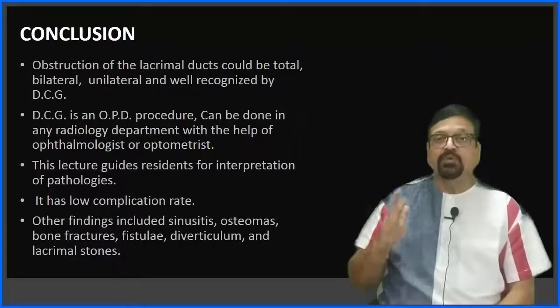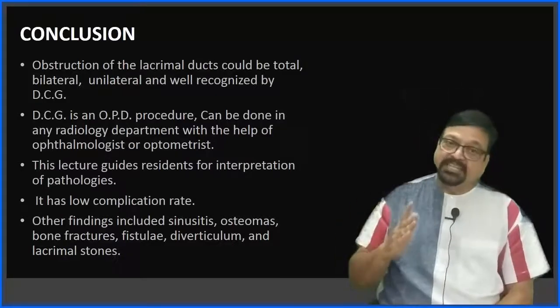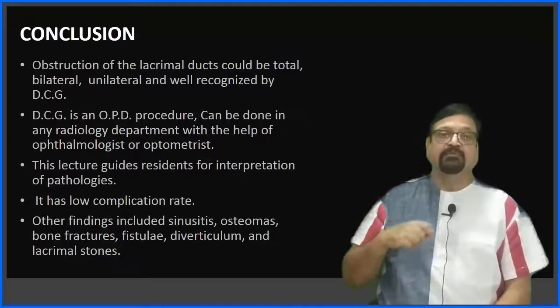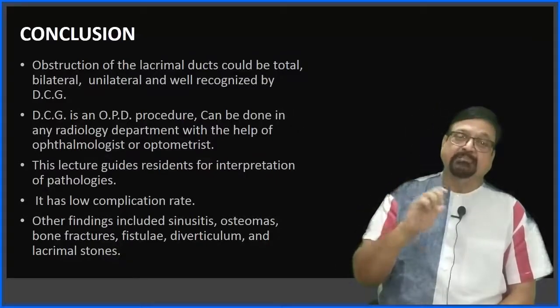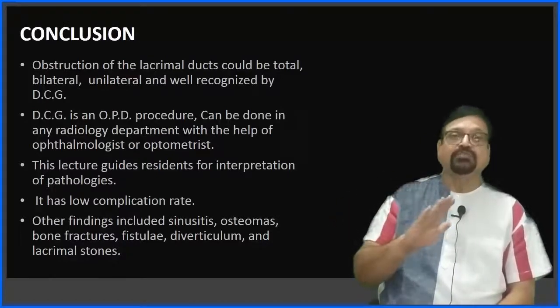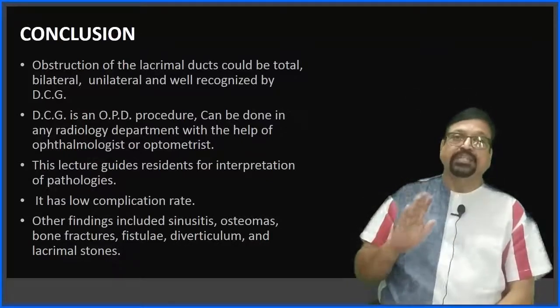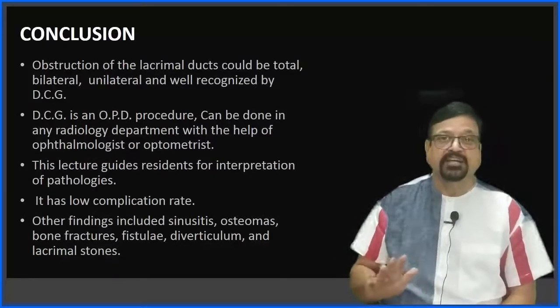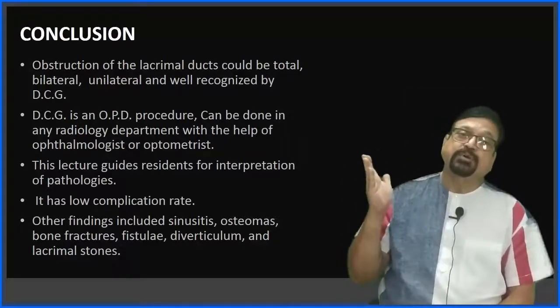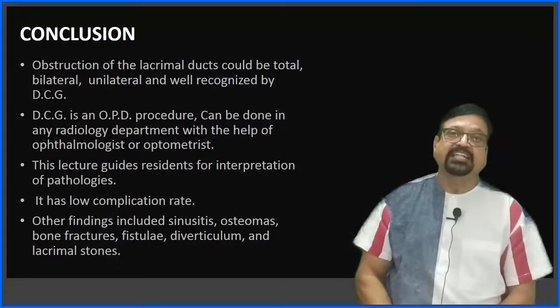But again, I told you, a patency under test condition and a patency during routine activity are totally different. We may get patency in the test, but the watering of the eye continues. In that condition, we have to think of some other conditions or some other test. Now with this, we are coming to a concluding remark. You have seen the images, you are now expert in reading them, and there is not much difficulty you should face after hearing this lecture.